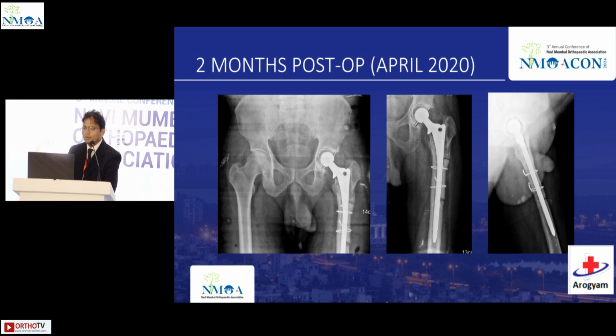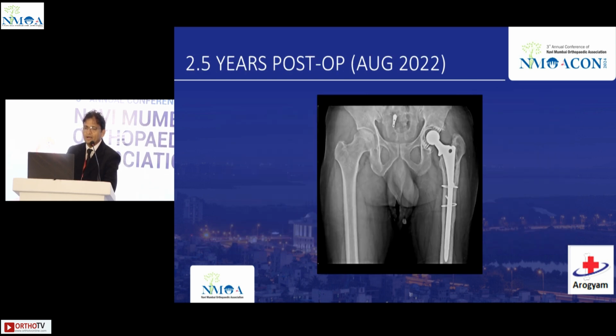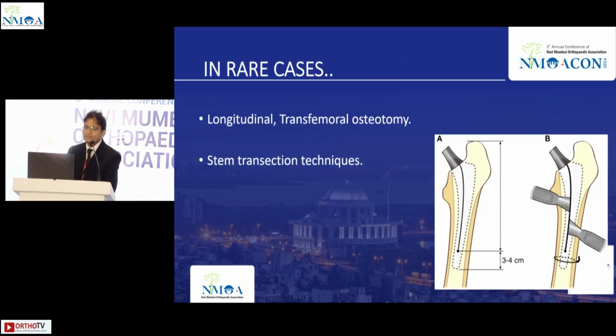And this was the follow-up, and at around 2.5 years you can see the osteotomy healed very well. So they do very well. In rare cases you may require a longitudinal or transfemoral osteotomy. I have no experience with this. I think Mohanty sir can put light on that. Stem transection techniques are also described in the literature.